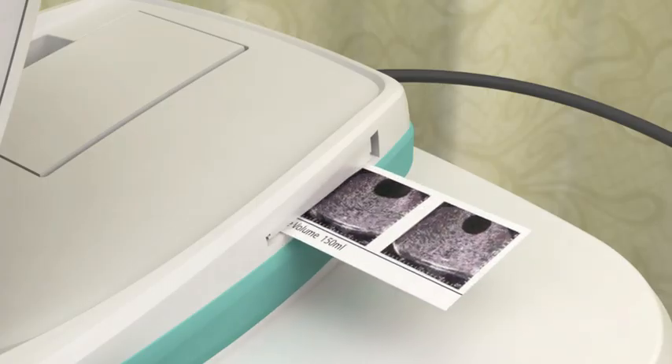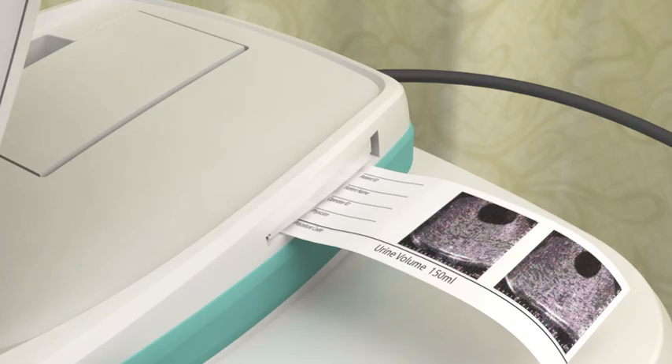When you have verified an accurate scan, the screen will display your results. Wipe the gel from the probe and the patient. At this point, you may record a voice annotation to save your exam, print the exam result from the onboard printer, or listen to previously recorded annotations and review data from saved exams. You can also return to the home screen and perform another scan, or turn off the instrument.